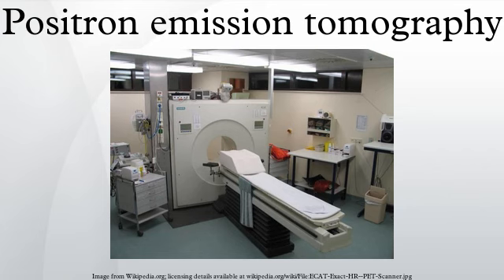PET scanning with the tracer fluorine-18 fluorodeoxyglucose, called FDG-PET, is widely used in clinical oncology. This tracer is a glucose analogue that is taken up by glucose-using cells and phosphorylated by hexokinase. A typical dose of FDG used in an oncological scan has an effective radiation dose of 14 mSv. Because the oxygen atom that is replaced by F-18 to generate FDG is required for the next step in glucose metabolism in all cells, no further reactions occur in FDG.